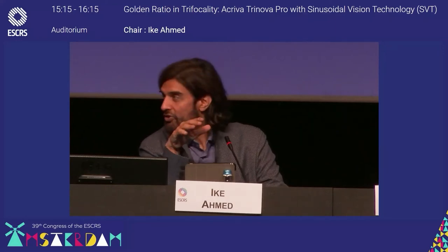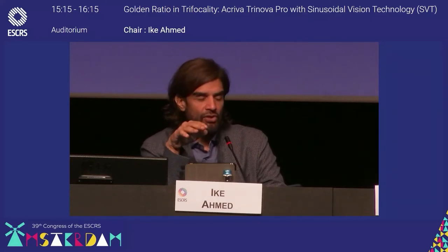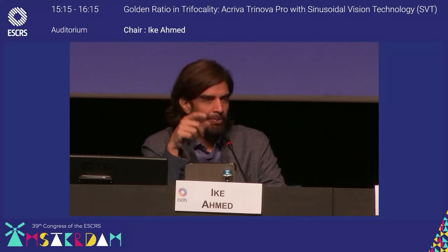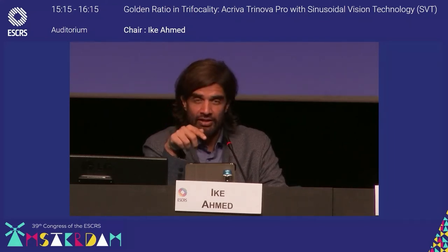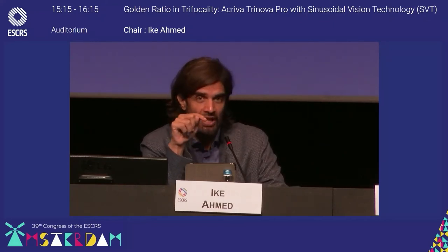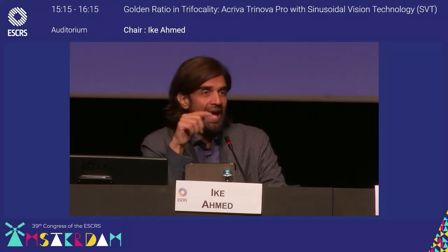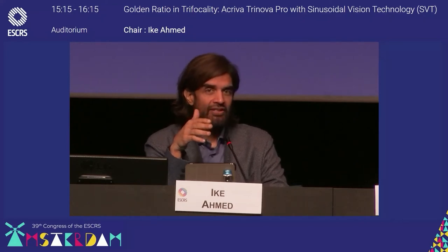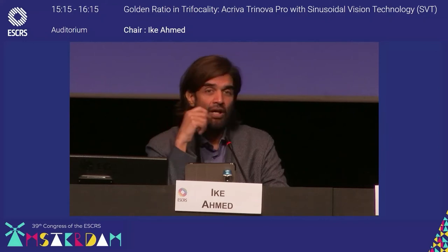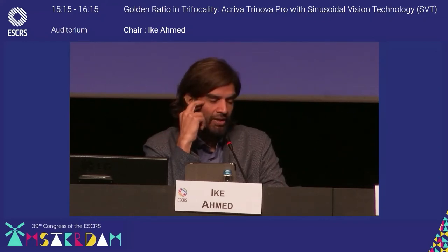That's a very good question, and I can maybe speak to that a little bit. There are a couple of things that are different. First of all, you can see the actual haptic design. It's gone from a plate to a C-loop, which I think is very good. The light transmission has gotten a little bit better. It was already good at 92%, now it's 93%. The adds have changed a bit. The near add on the new one is 3.6, and intermediate is 1.8. It was a little bit less on the previous model as well.